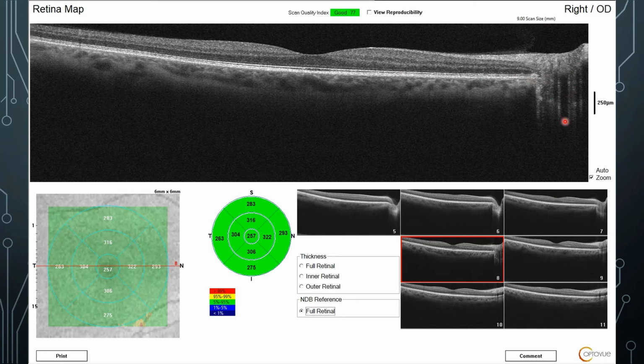This is the optic nerve going back. And then this is the little pit where the fovea is, and this is the area that's responsible for your sharpest, clearest vision. And it does several more cuts. It actually does, let's see, 7 cuts through here, high resolution cuts.